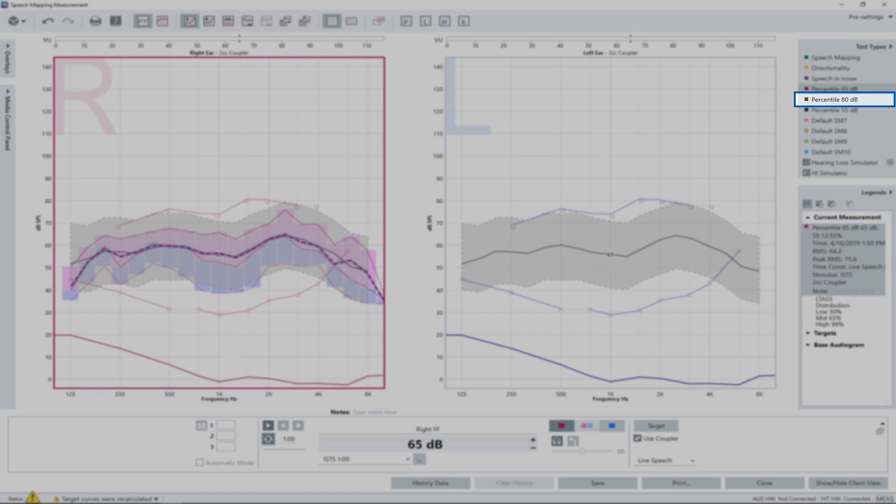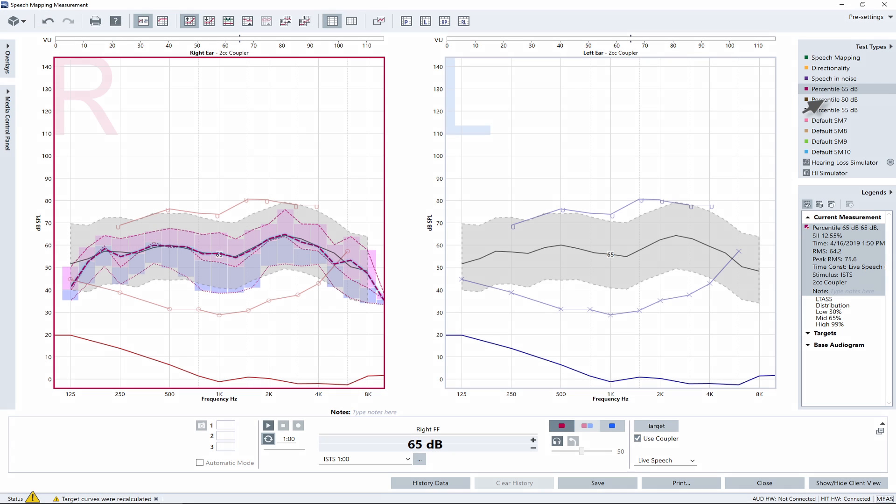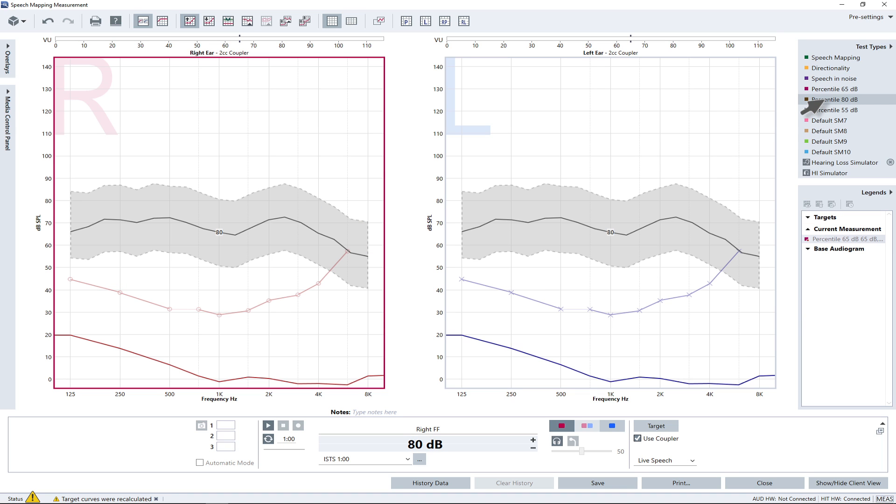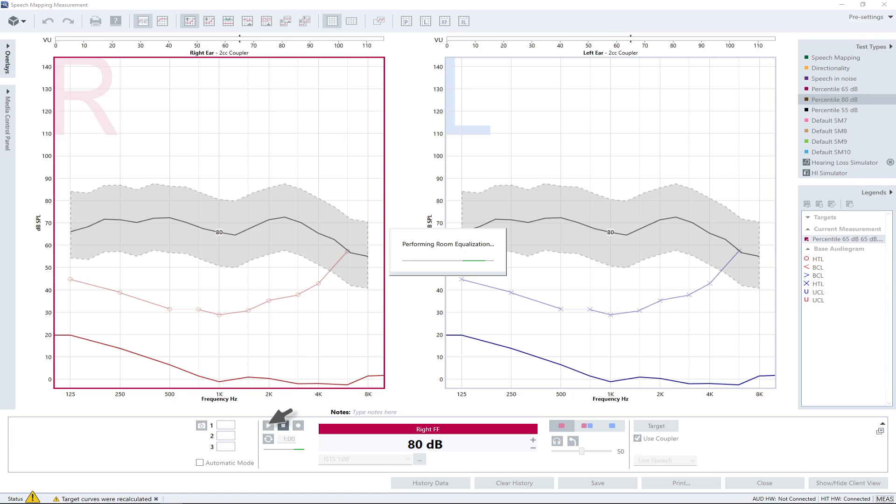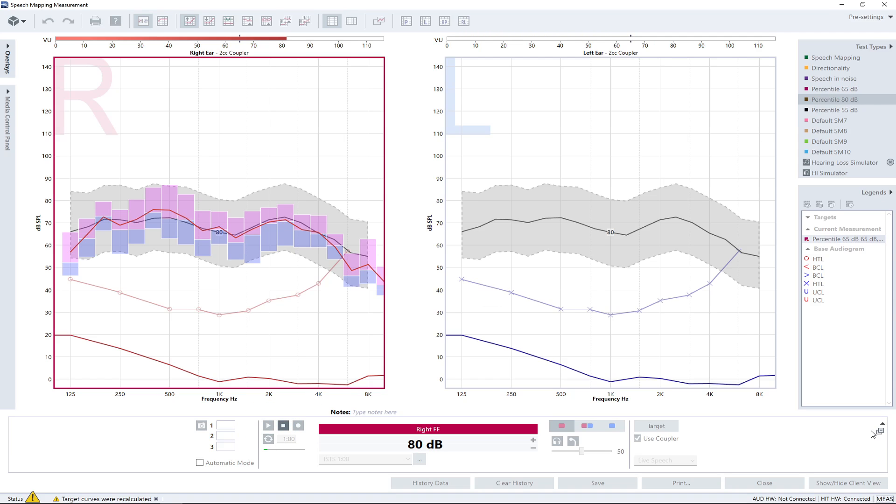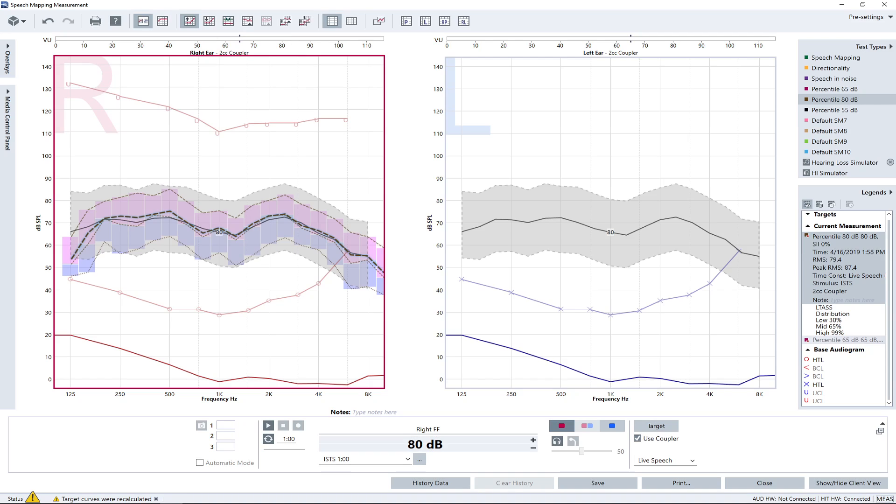To verify this, run a percentile measurement with an 80 dB input level and select the entry Percentile 80 dB from the test list to load the test settings necessary. An averaging time window of one minute should automatically be set to ensure compliance to measurement standards. As we can see, the LTAS curve matches the 80 dB target curve fairly well already. However, it is important to check that the upper ends of the pink bars are not exceeding the uncomfortable loudness curve. If this is the case, adjust the gain for loud sounds accordingly.